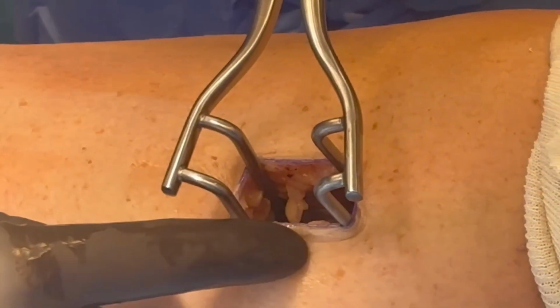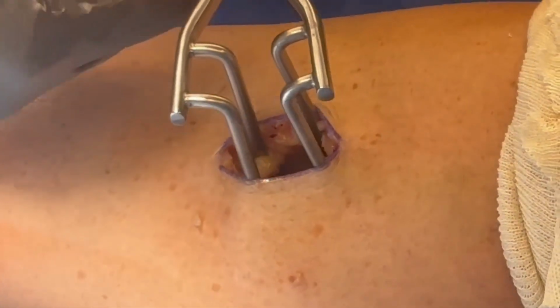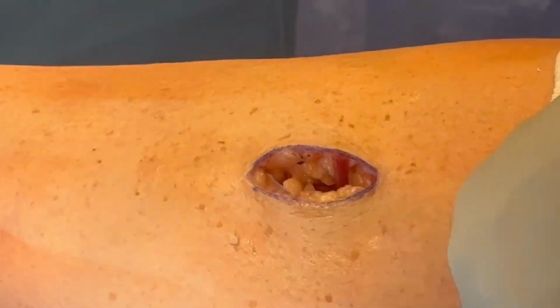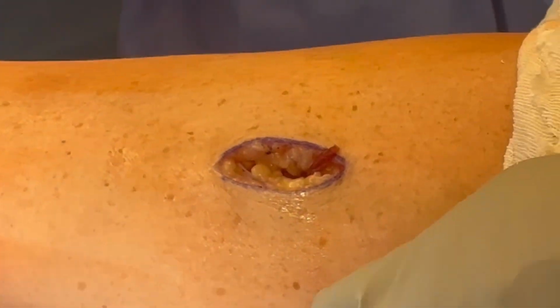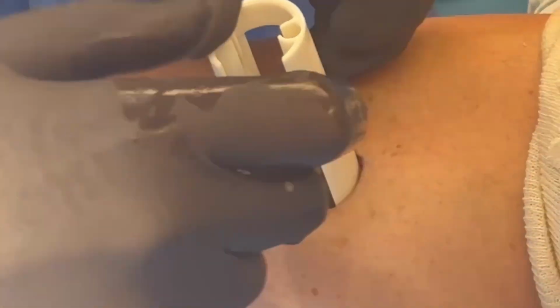Now I'm showing what I used previously, which is a Sims rectal retractor, and you can see how much tension is on the skin. I think this is a big reason that we see wound dehiscence: the tension that's placed on the skin from this retractor, and I'm showing that here.